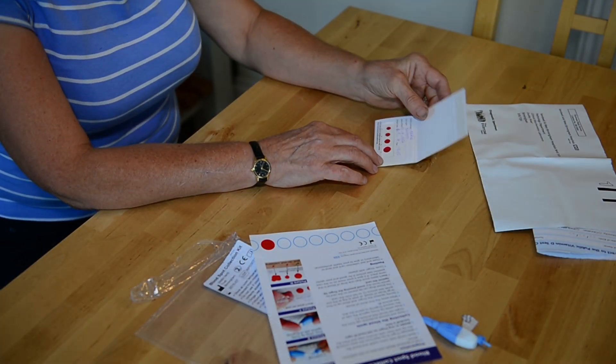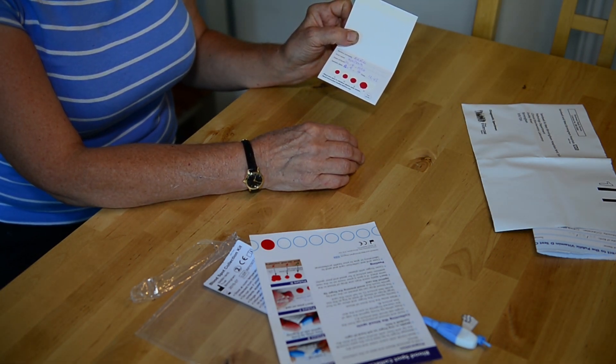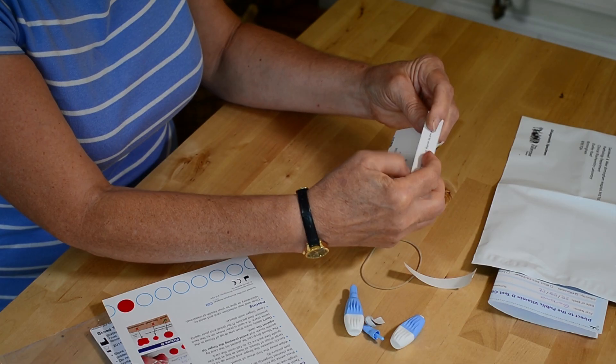Gently squeeze your finger and allow up to four large drops of blood, at least as big as the size guide, to fall onto the card. All you need to do now is close and seal the collection device.